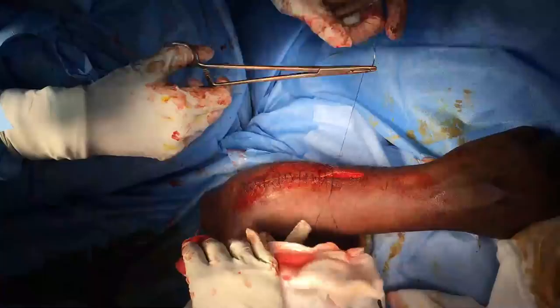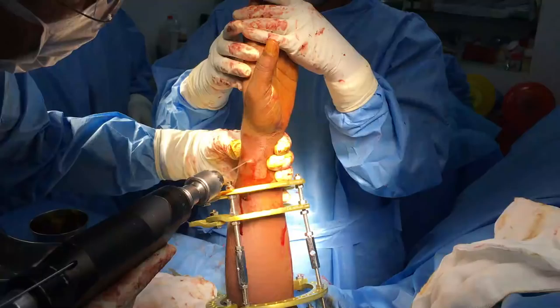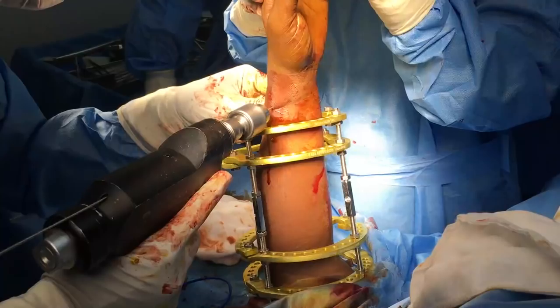The wound is closed in layers. The frame is now slid over the forearm and ensured that it is sitting properly. The first wire is ulnar-radial, one inch below the ulnar styloid, transversely passing through both ulna and radius through their mid-shafts along with the interosseous space.